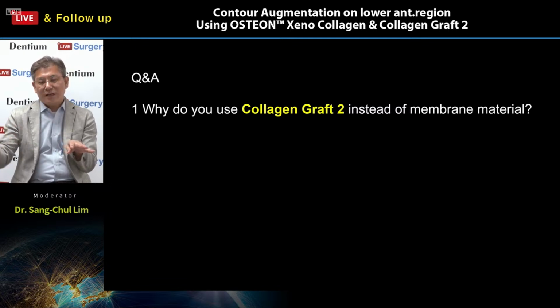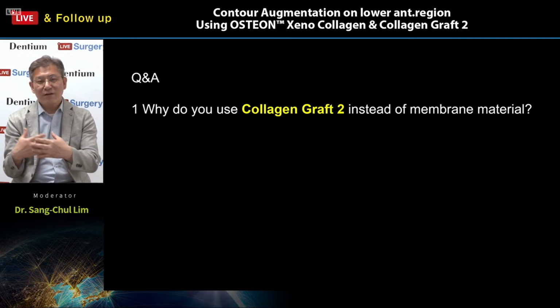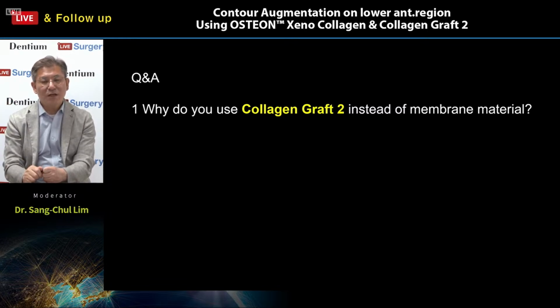First one is protecting the underlying bone graft materials for new bone formation. Another one is matching to soft tissue and making soft tissue healing faster, right? Also, a little bit of auxiliary function is protecting the underlying bone graft material, right? So if you want to have 100% newly forming bone, which is the aim, you have to use this barrier membrane.